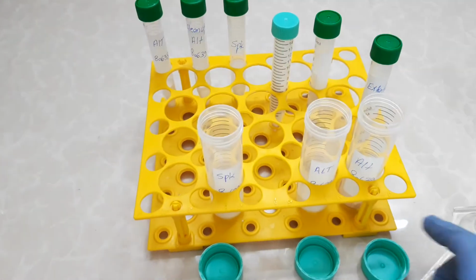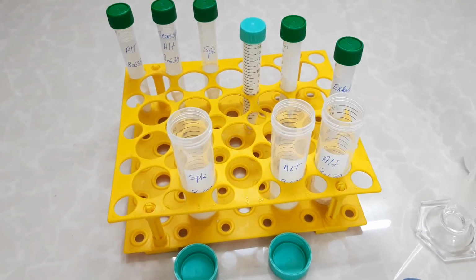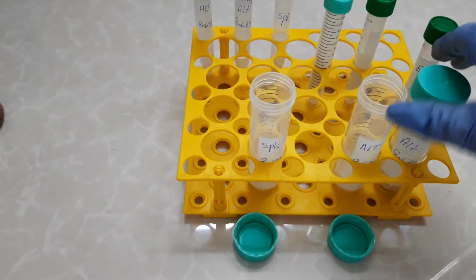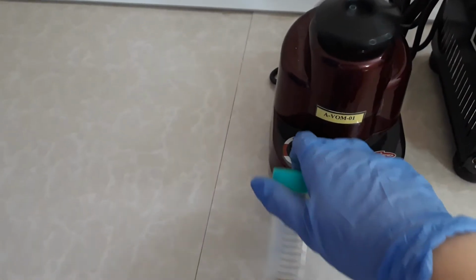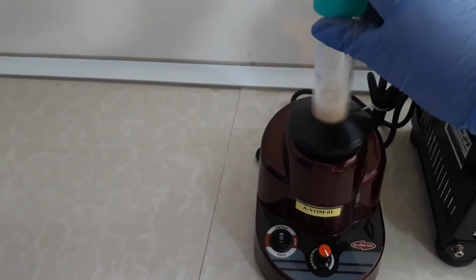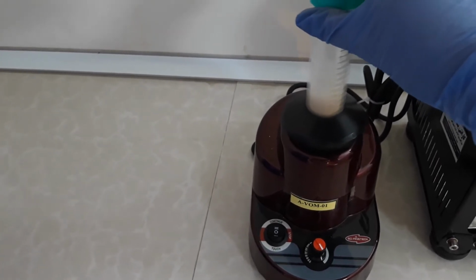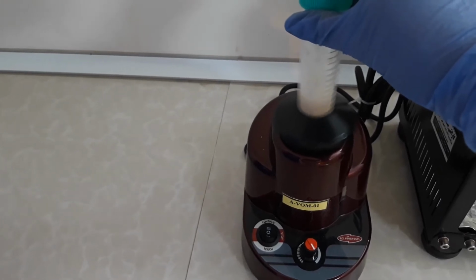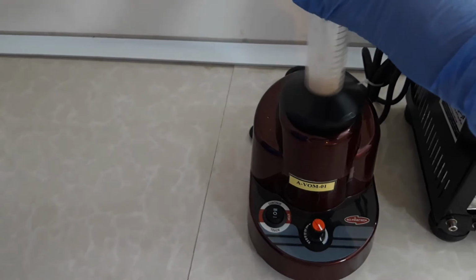Then close the cap, shake it and vortex it, to make sure the mixture is completely mixed, and then leave it for 5 minutes aside.